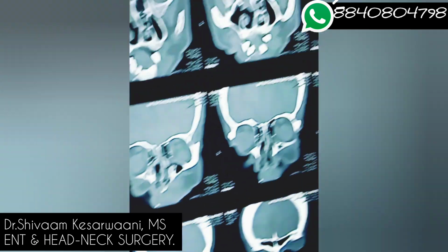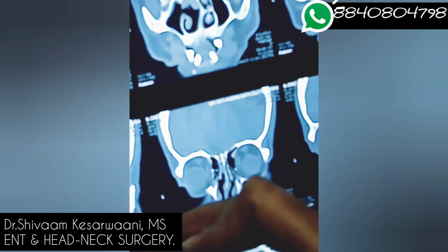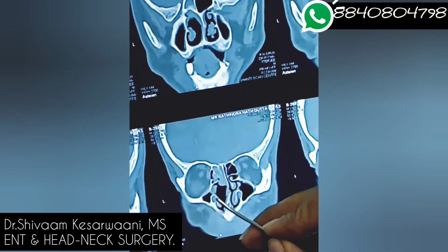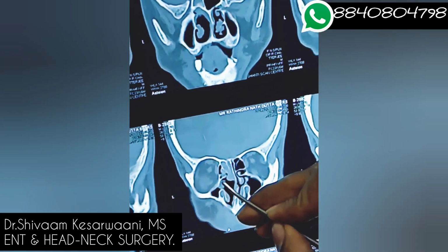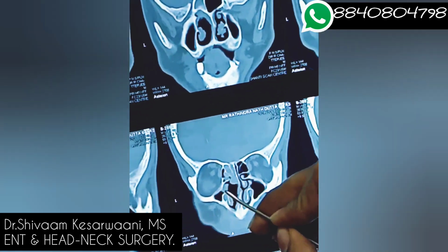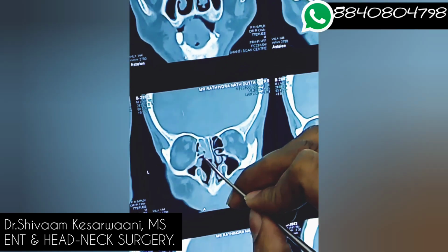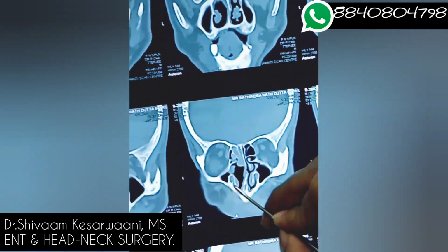The crista ethmoidalis. Now here the ethmoids have started to appear. The maxillary sinus, the right maxillary sinus, the left. And if we see in this cut, it is more clear that this side is operated. That means the right side has been operated. Here we can see some soft tissue density in the ethmoids, both the anterior ethmoids and at the osteomeatal complex. So the importance of radiology is to see the extent, to see the origin. Seeing the origin of the tumor and the extent of the tumor is very important, because we are going to stage this inverted papilloma.